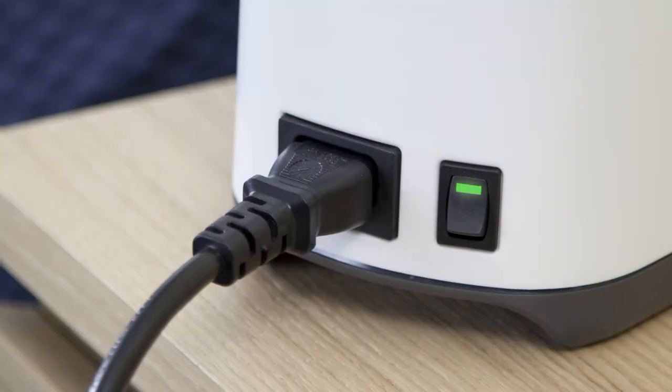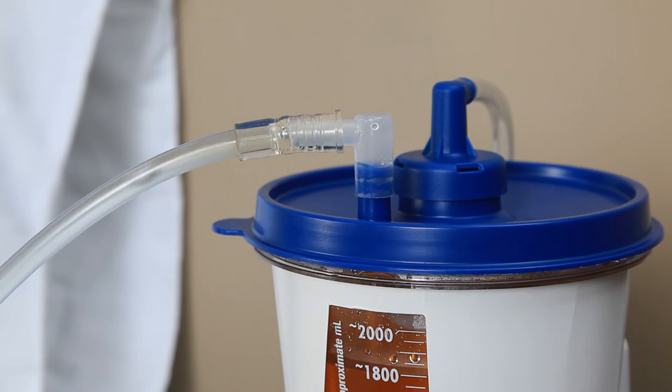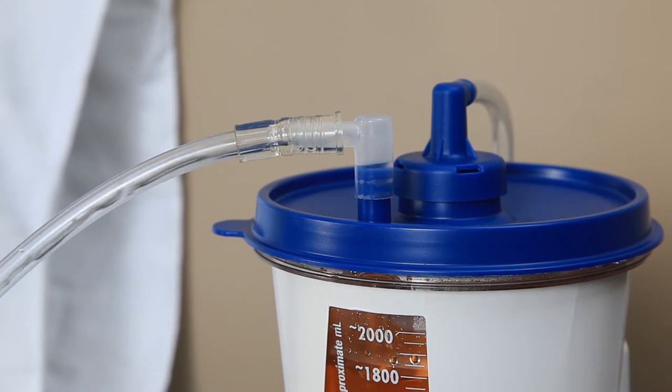Keep the Purewick urine collection system on to make sure all urine has been drawn out of the collector tubing and into the collection canister before removing the Purewick female external catheter.